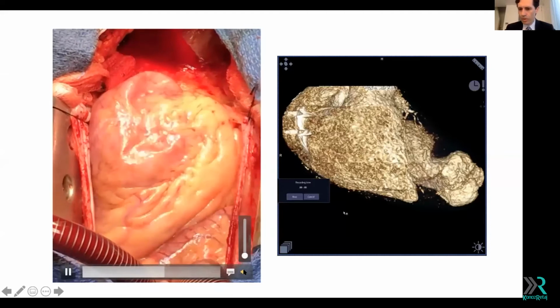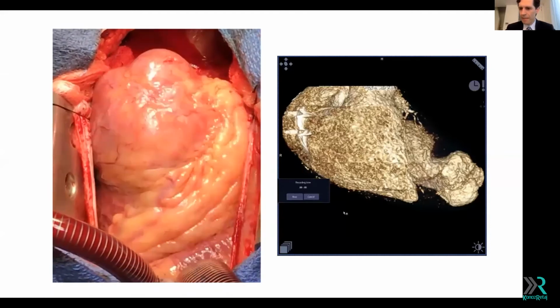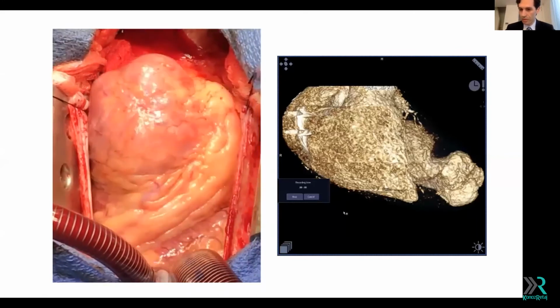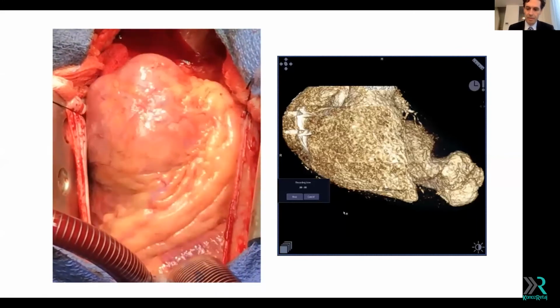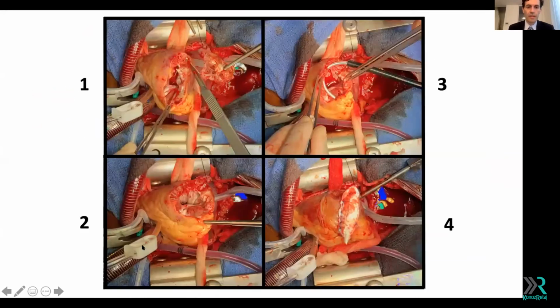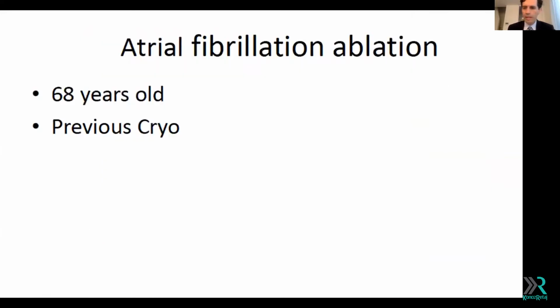in the operating room. You can see that the apex of the ventricle collapsed, and that fits very well with what we did during our EP study. So in this context, we decided with the surgeons to do an ablation and elimination of the aneurysm, and the patient after 2 years is asymptomatic with no recurrence of arrhythmia. I also would like to focus your attention on other substrate.